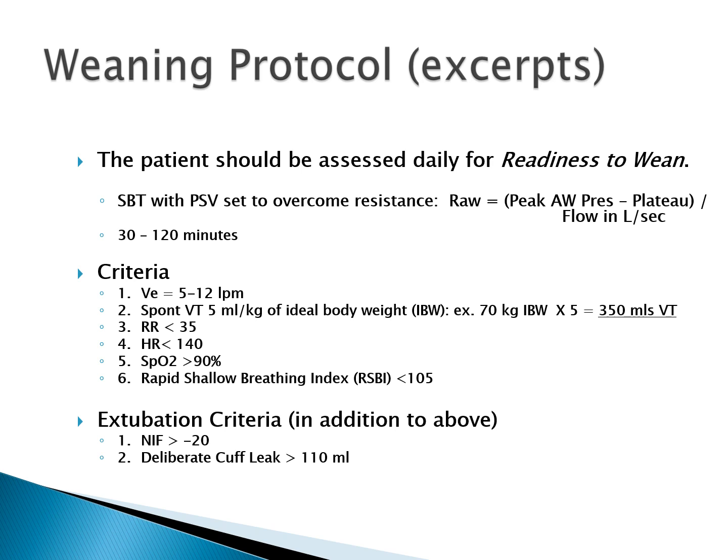Hopefully the respiratory rate is south of 35. Heart rate is less than 140. Some of the protocols say less than 120, but many times you'll see heart rates slightly elevated in the low 100s in the ICU just because of the stress that these patients are under. Saturation is north of 90. Some of the protocols say 92, but it depends on your patient population. And the RSBI south of 105, or sometimes they'll say between 30 and 100, something along those lines.